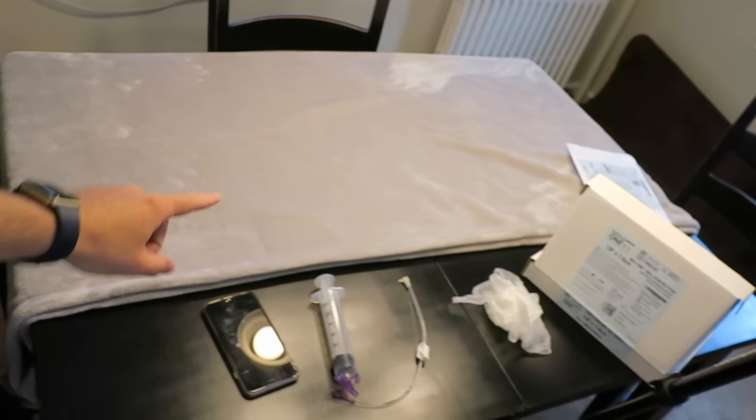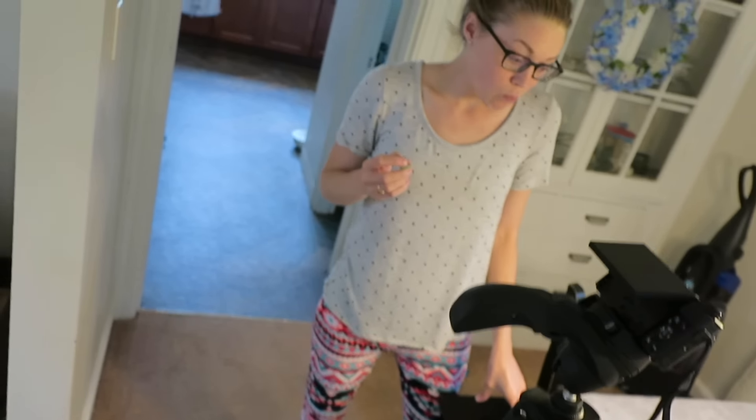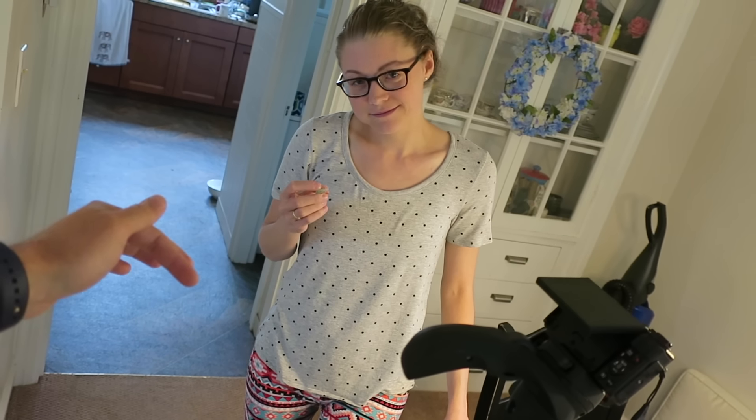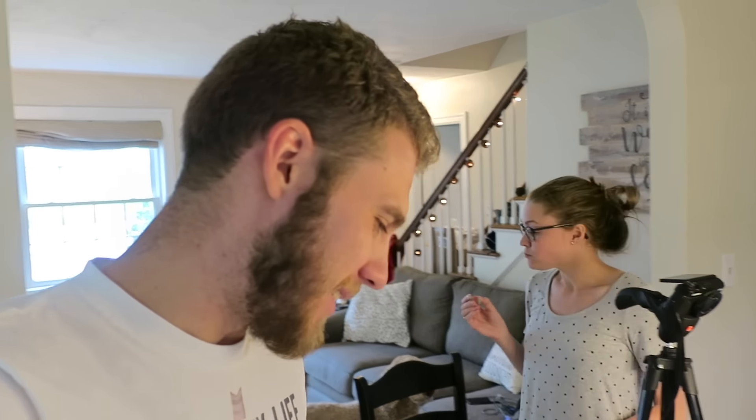Alright guys, we're getting ready to change Mary's feeding tube button and we've got a camera set up. We're going all out here — we even had Mary swallow a camera and we had to time it just right for when the camera would get to her jejunum. Just kidding. We want to show you guys the process because it's our first time and we find it kind of fascinating. Maybe you have a feeding tube, maybe you're just curious or whatever else — we're gonna show you what it's like.